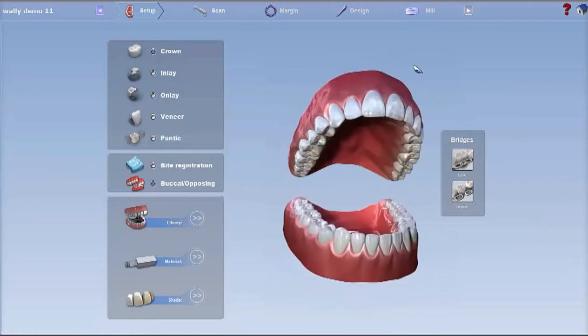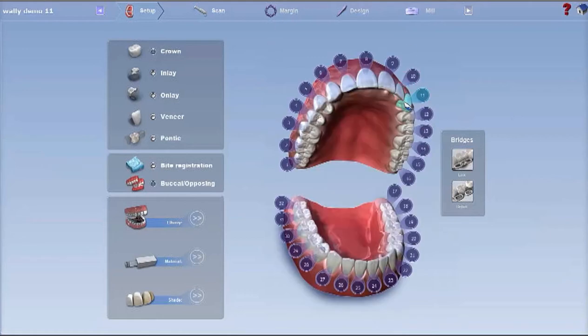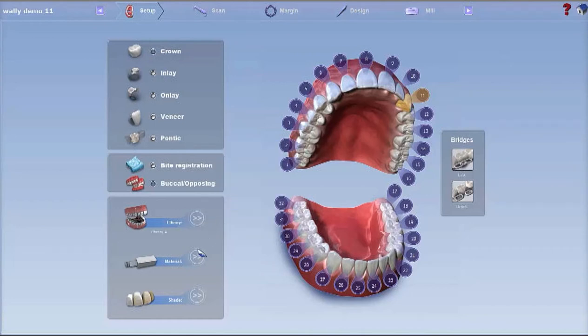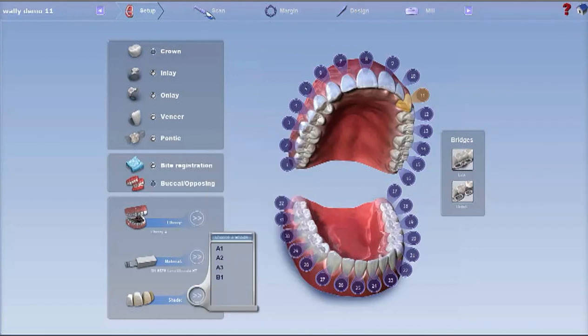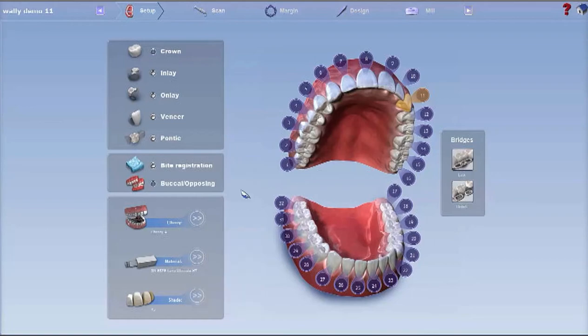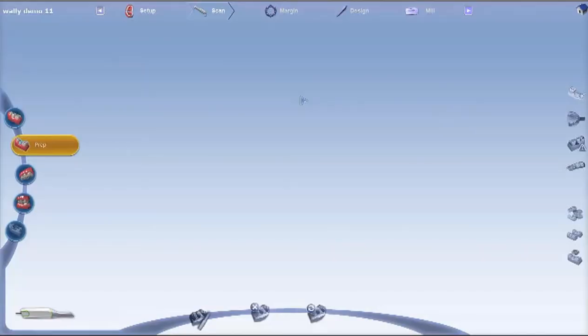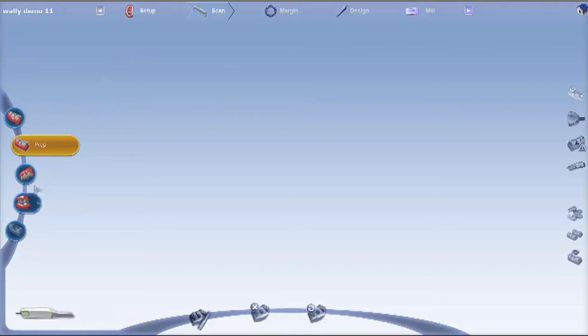Select the tooth by clicking on the actual tooth, not the tab, then randomly fill in these items which are not important for grading purposes. It's important that you're under the prep scan folder. Sometimes it defaults to other folders, so make sure prep is highlighted orange there.